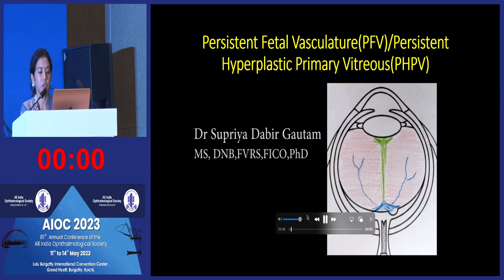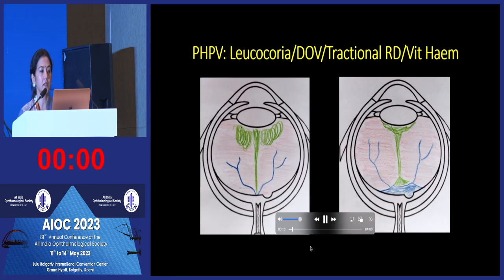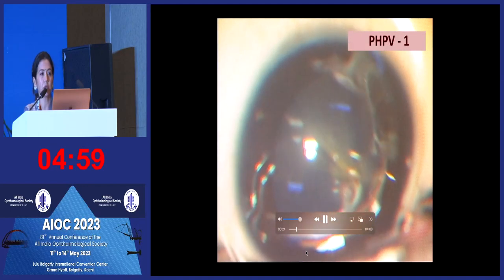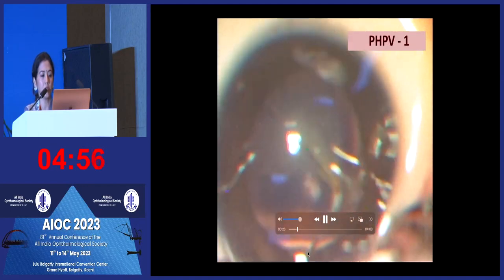So I'm just going to show a few cases of PHPV. As you can see, the children can come to you with leukocoria, decreased vision, tractional retinal detachments, or vitreous hemorrhage. This was a two-year-old child with leukocoria, who ended up with, on B scan, you could see the stalk from the disc to the lens, vitreous hemorrhage.